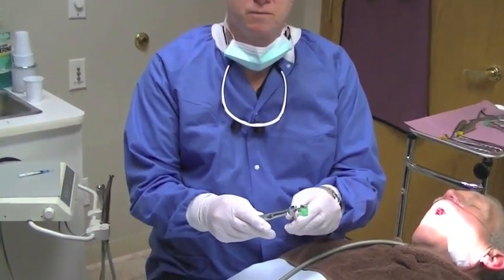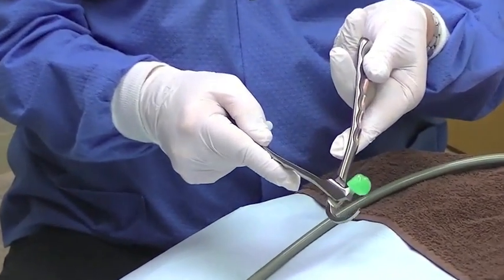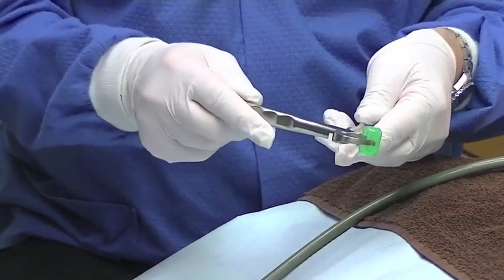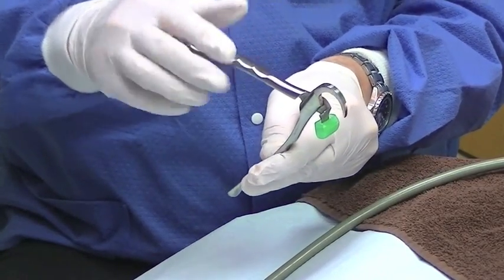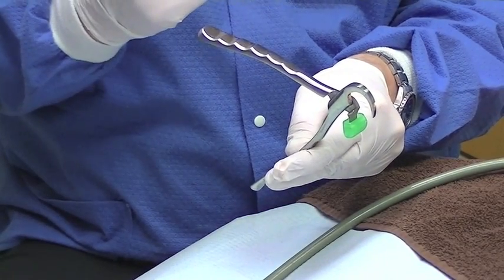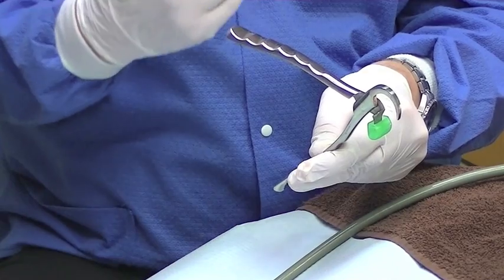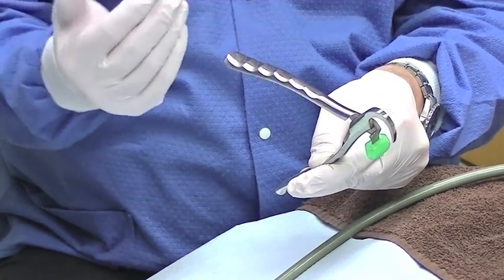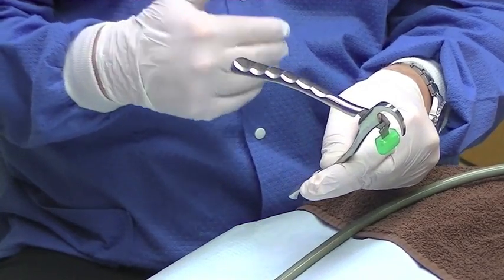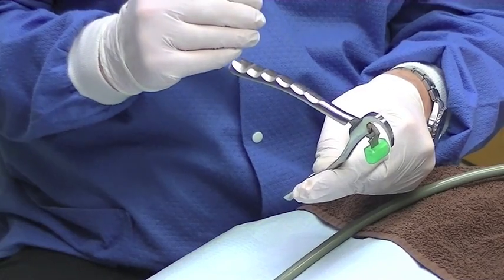If we can just show the forceps — we'll do the lower ones first. The standard set consists of four instruments: the lower universal, then there's an upper right, upper left, and upper anterior. There's also a 400 series, which is used primarily for the posterior maxilla and mandible, and we'll demonstrate those when we get to the other side of the mouth.